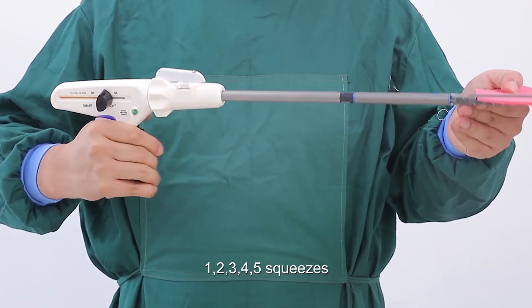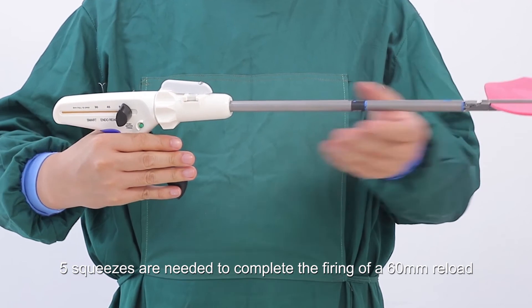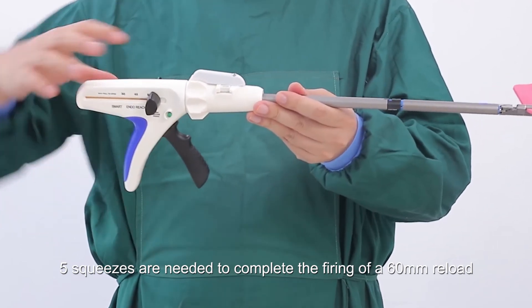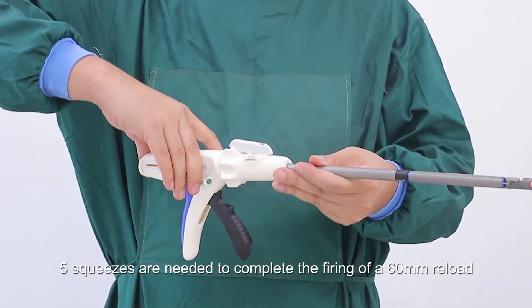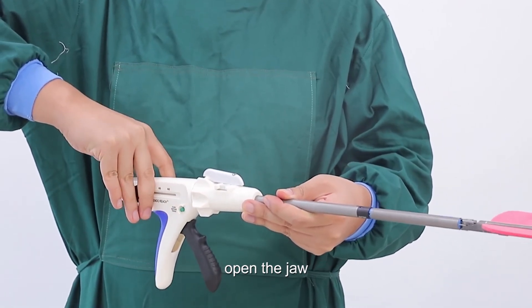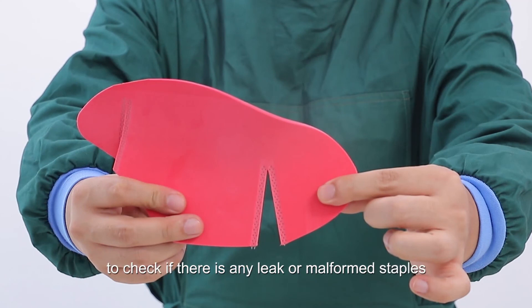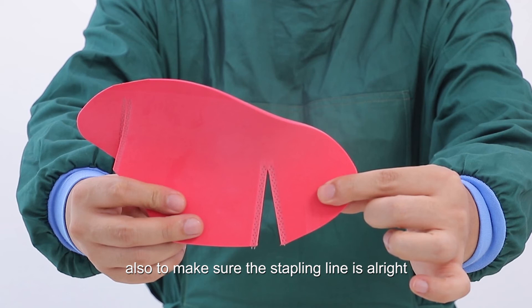Hold the handle and fire the instrument by pressing down the trigger slowly and steadily. Five squeezes — one, two, three, four, five — are needed to complete the firing of a 60mm reload. Pull the return knob to the initial position and open the jaw. Inspect the stapling line to check if there is any leak or malformed staples, and make sure the stapling line is all right.